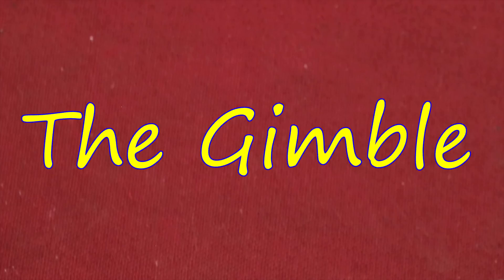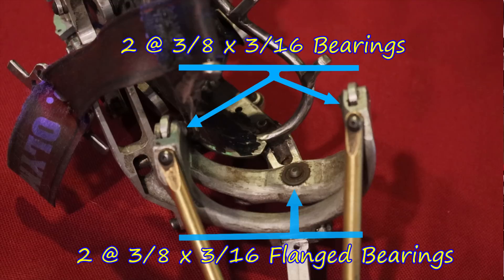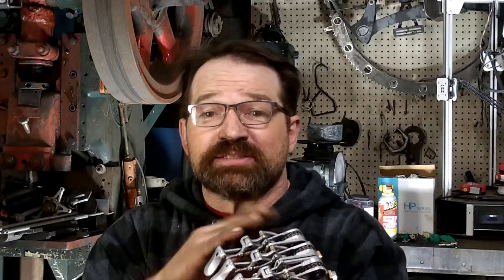This leads us to the gimbal. Not really a lot to say about the gimbal. The 5-bearing design that I used on the 158 has proven to be super reliable and pretty low maintenance, far more so than the 4-bearing setup used with the 156. The use of dual thrust bearings and a single deep groove bearing really locks the gimbal to the socket and eliminates any perpendicular rotation of the two parts.